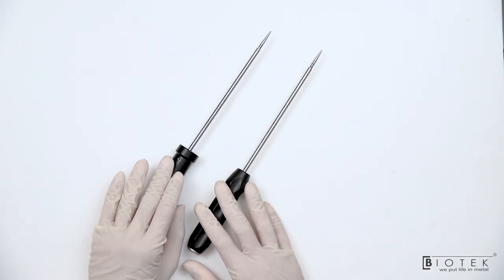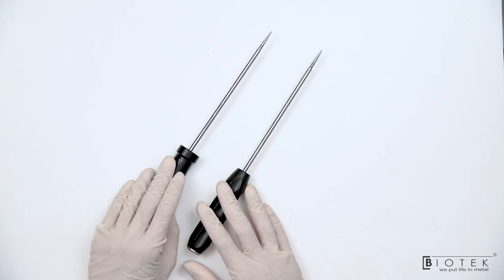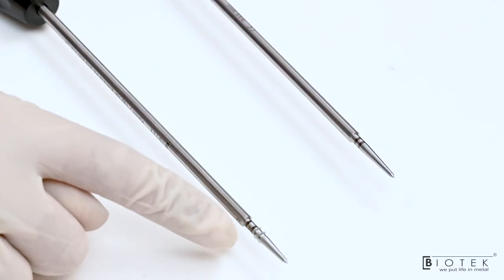These two instruments are used for insertion of rotator cuff anchors. This is punch and this is punch tap.